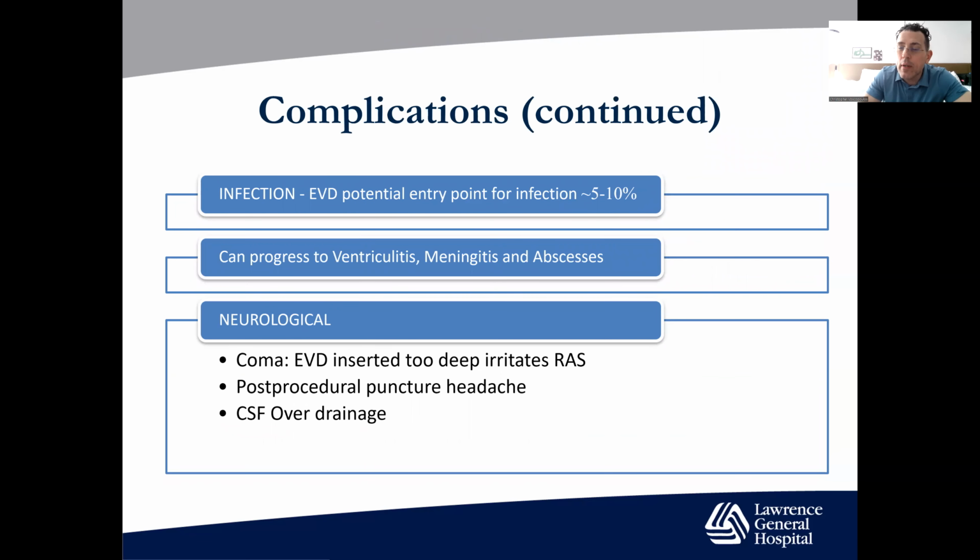You could possibly have infection of the EVD. And infection is strongly correlated with how long you're going to leave the EVD in. So say if it's left in for more than 7 days or so, the risk of infection starts to dramatically increase. And this infection could progress to ventriculitis, meningitis, and possible abscess. Or you could have neurological complications. Say if you place the EVD too deep, you can go into the reticular activating system and cause coma. You can have a post-dural puncture headache, similar to what we have in anesthesia when we do epidurals. Or you can have over drainage of CSF, a topic that we'll talk about in some detail.